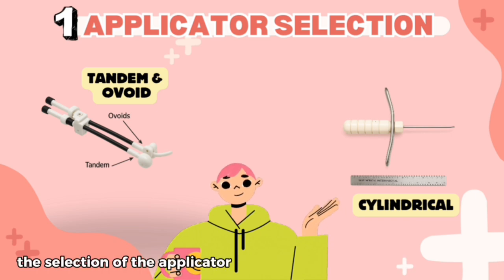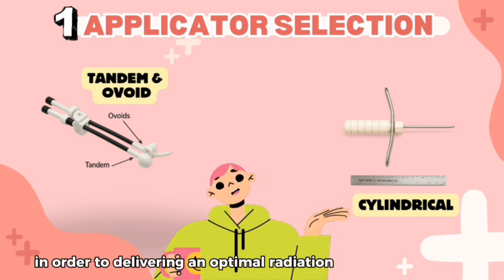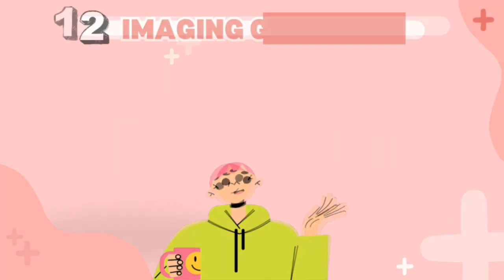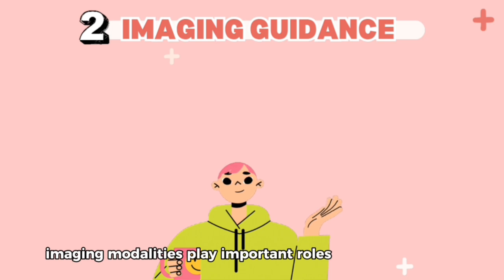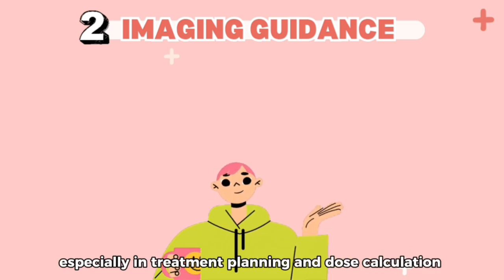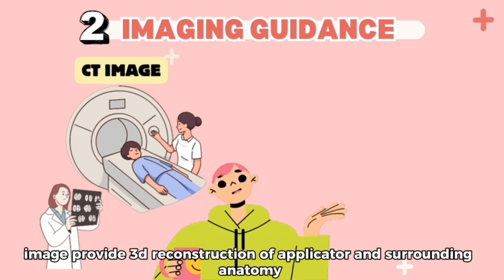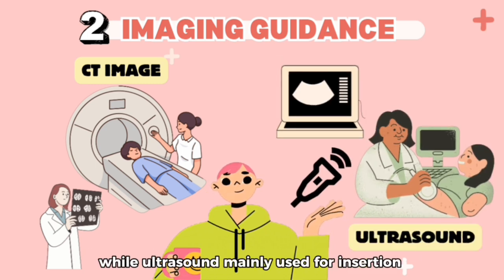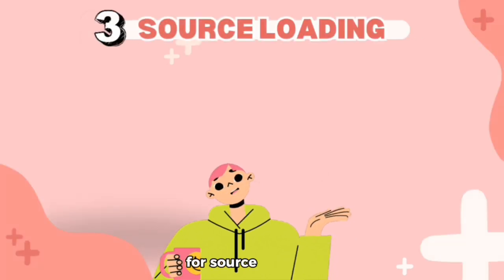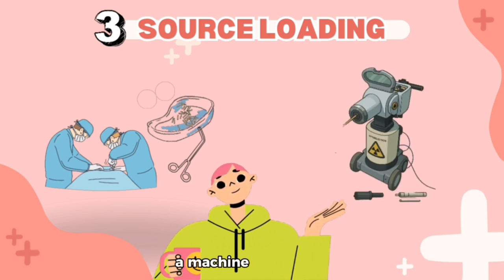The selection of the applicator is based on the size and tumor location in order to deliver an optimal radiation dose to the tumor while minimizing dose to surrounding normal tissues. Imaging modalities play important roles in image-guided brachytherapy, especially in treatment planning and dose calculation. CT images provide 3D reconstruction of the applicator and surrounding anatomy, while ultrasound is mainly used for insertion guidance of the applicator and aids in avoiding perforation. For source loading, we can choose either the manual technique or a remote afterloader machine.